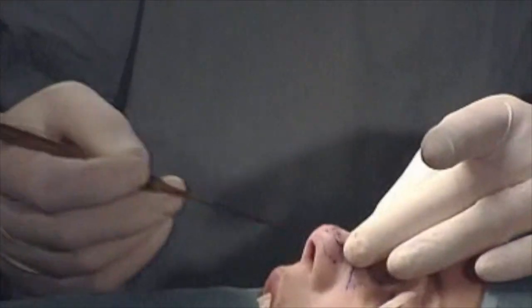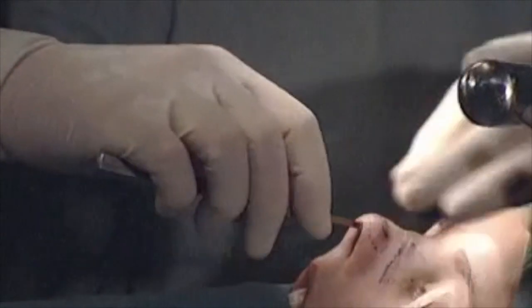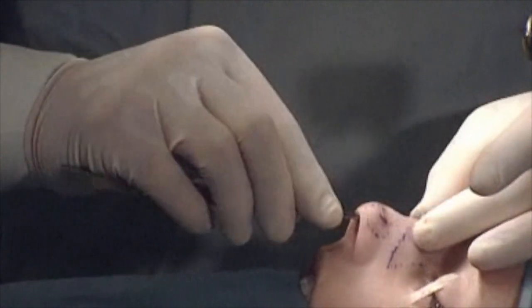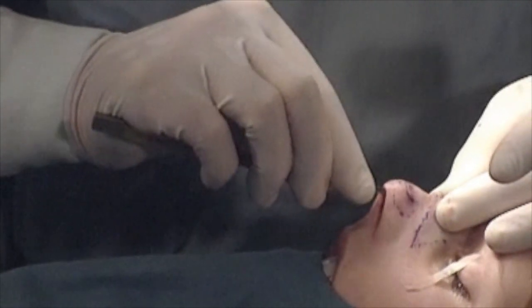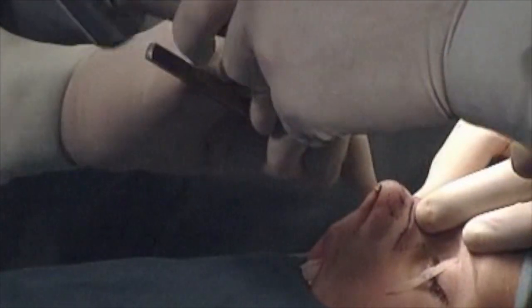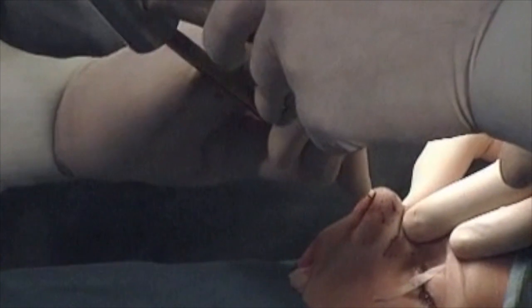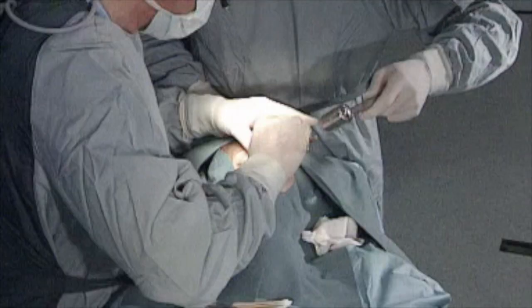Now we go to the other side. As high as possible. Yes, very quiet. Start very quiet until you're in the right side, right direction. Yes.